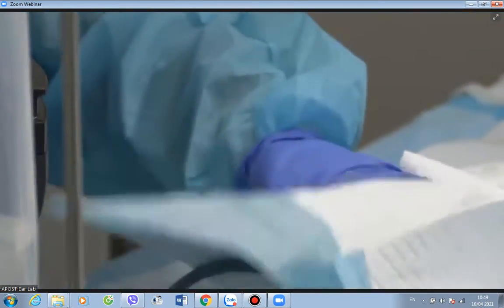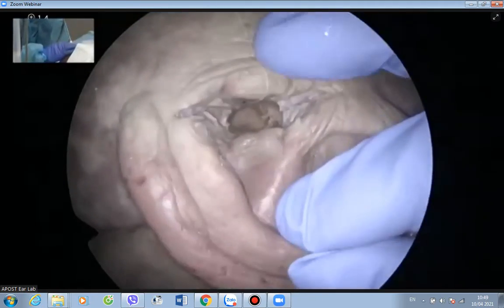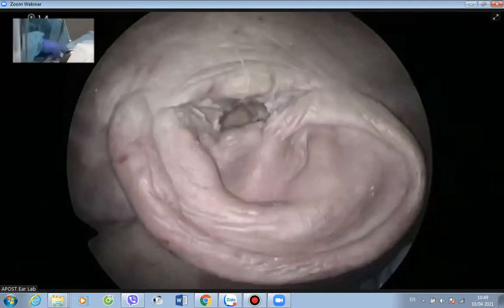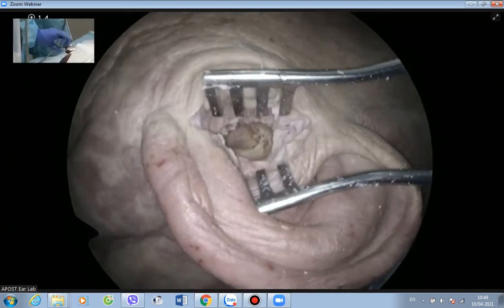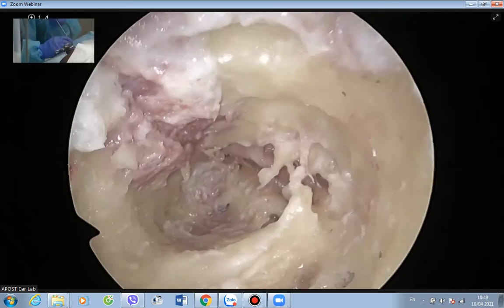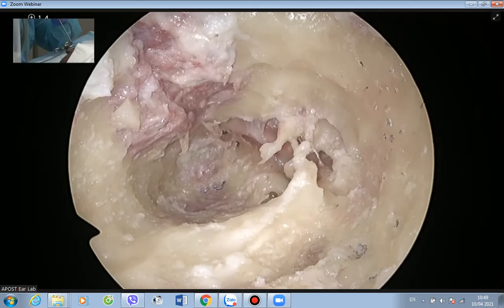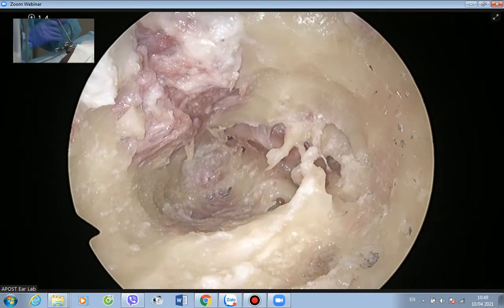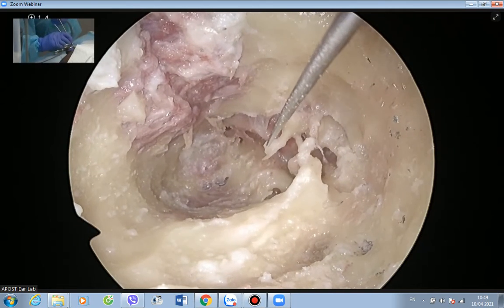Okay. So I want to show you this. This is some pre-drilling transcanal approach to the IAM. So we do not have a post-auricular incision, but we have the transcanal incision. Just through this transcanal incision, we can actually expose everything. So what I have prepared for you, while Professor Tong is drilling, is the transcanal anatomy of everything that you have seen and you'll be seeing, because the approach is quite different.